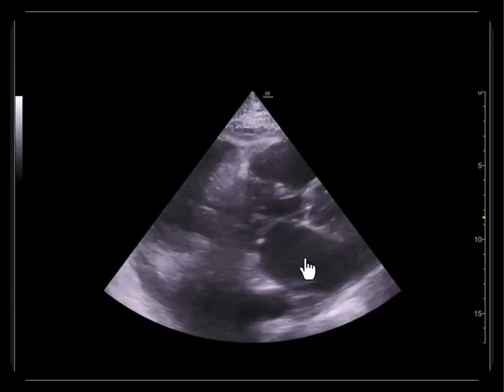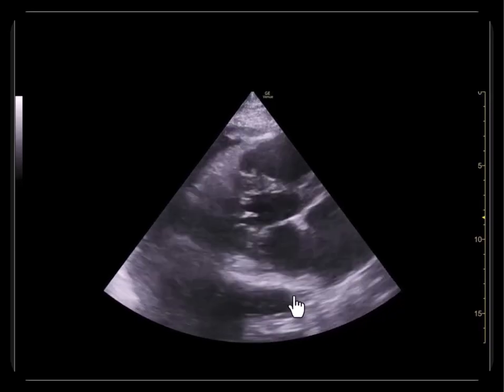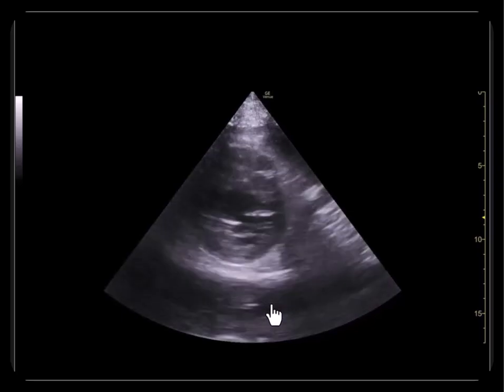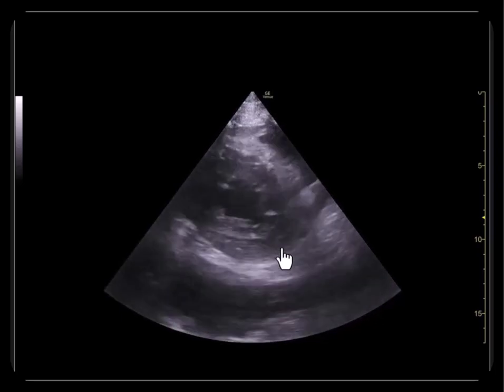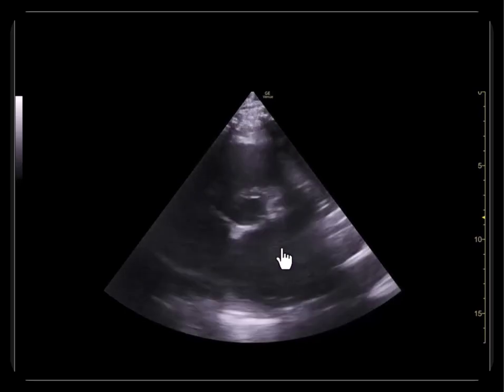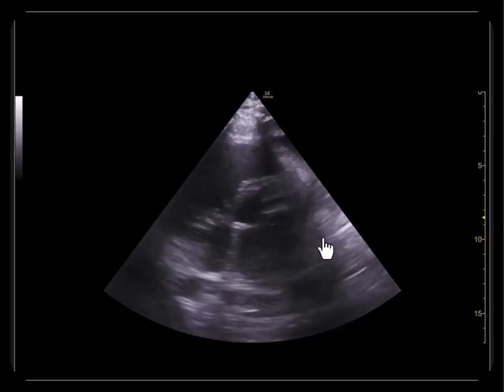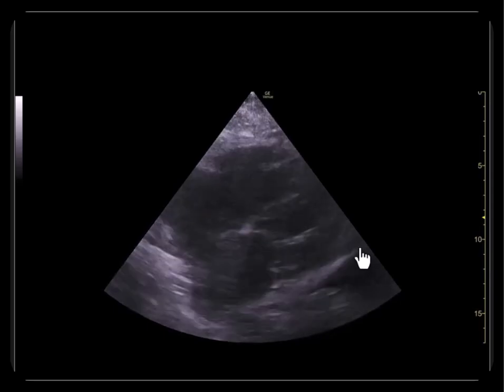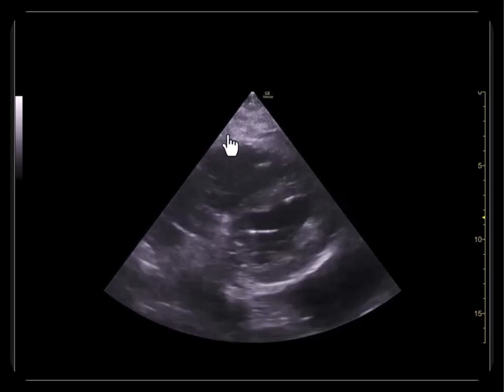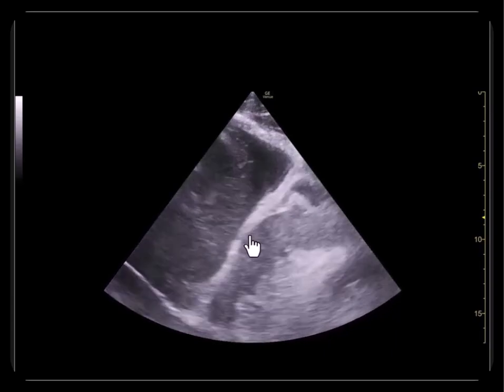So here's that example. Here is that fluid collection wrapping around the left ventricle. Here's the thoracic aorta. It doesn't appear to come around the ventricle in the short axis view. In a 4-chamber window, I do not see it at the apex. Moving to a subxiphoid view here, again, I no longer see that fluid collection. I'm suspicious it is in the lung. So I'm going to a PLAPS window here. And indeed, here's the diaphragm.